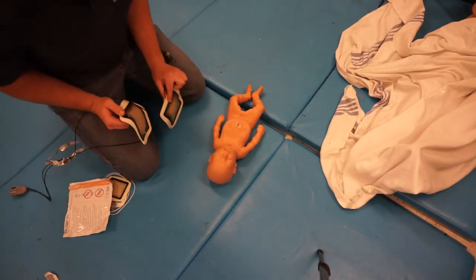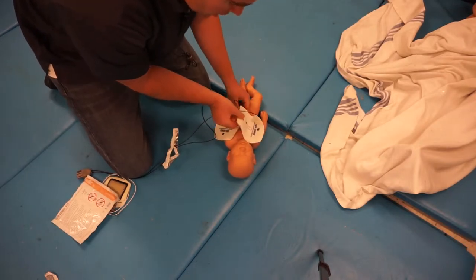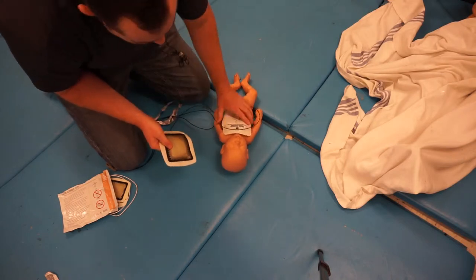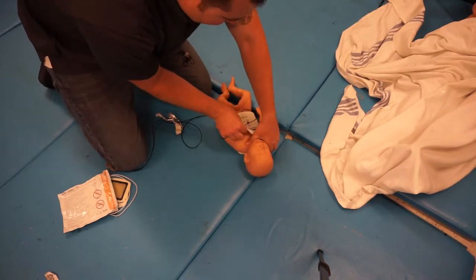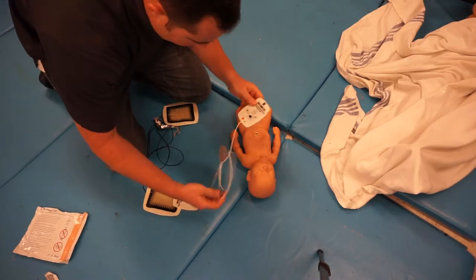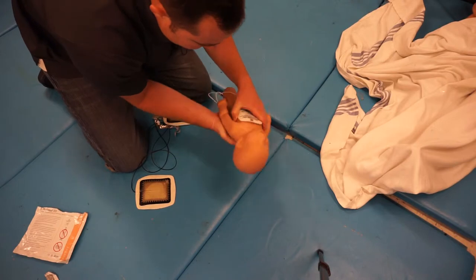When placing pads on a small child, adult pads are massive. If the pads would touch each other, don't use that placement — instead, place one pad on the front of the child and one on the back. Pediatric pads are smaller, but depending on the size of the child, you may still need to go front and back. Remember: pads must never touch each other.